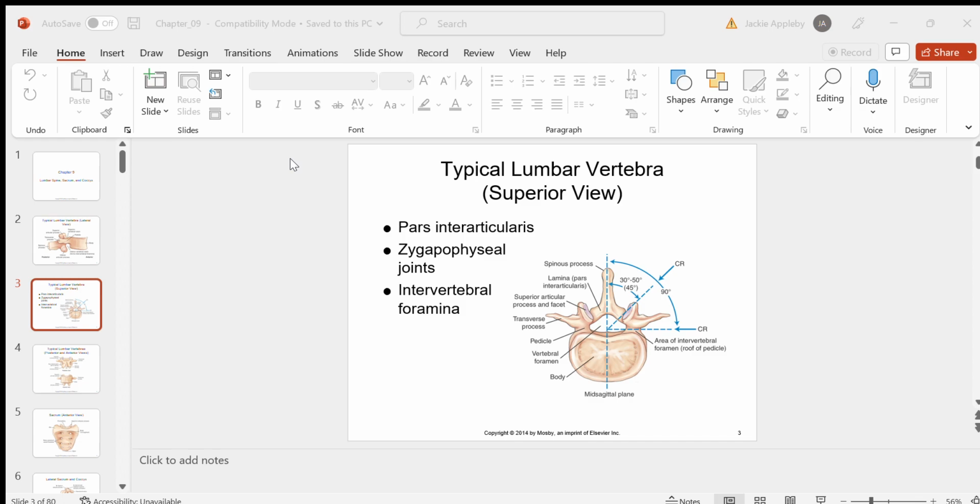Also take note of our articular surfaces, okay? Making the sacroiliac joints with the ilium, either ilium, left and right ilium of the pelvis. And the SI joints are one of our essential projections, so we'll learn this joint space as well.